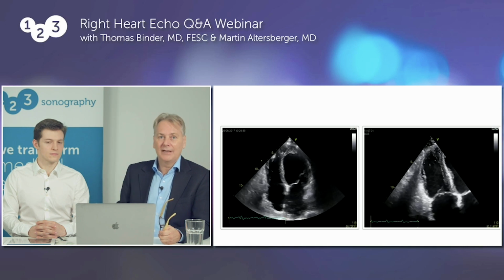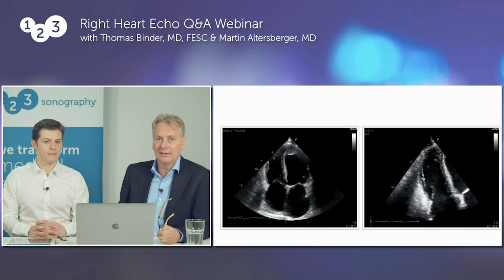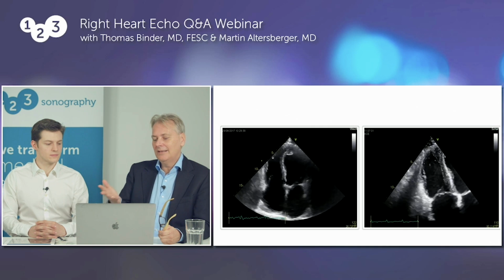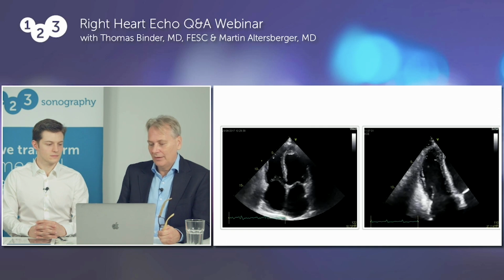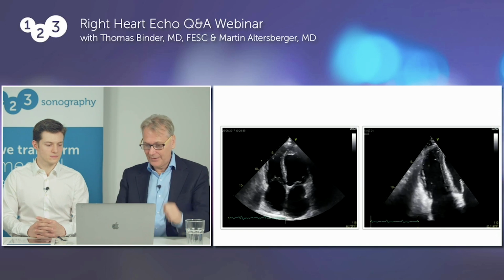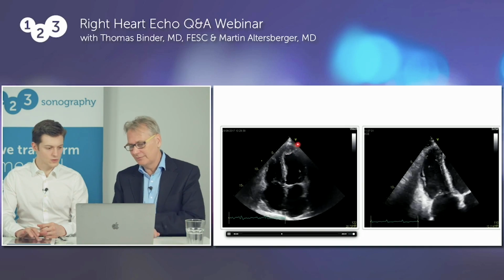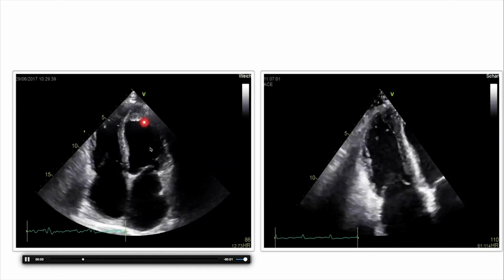We know that the survival rate is quite high. I don't know the figures at this point, but you see patients that live 15, 20 years, even more, after transplantation. This patient had a problem 3 years after, and this is now his echo. I guess you will appreciate that we have poor left ventricular function. The left ventricular function is poor, and there's also something here in the apex.